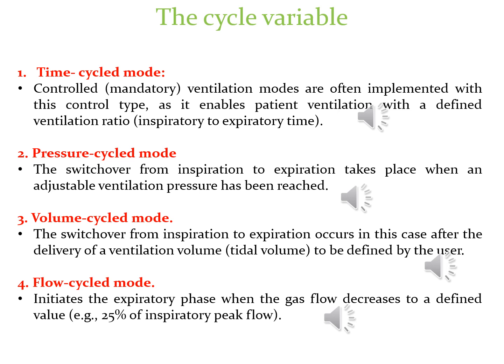Volume cycled mode. The switchover from inspiration to expiration occurs, in this case, after the delivery of a ventilator volume, or tidal volume, to be defined by the user. The next inspiration takes place after a time phase has elapsed, volume time cycled mode, or by a patient activity.